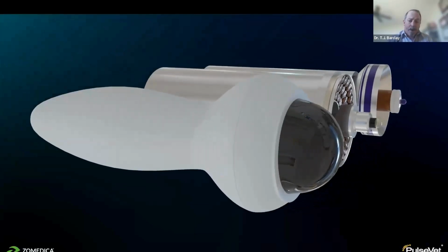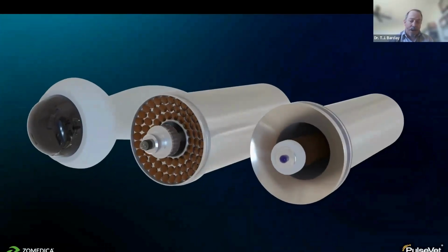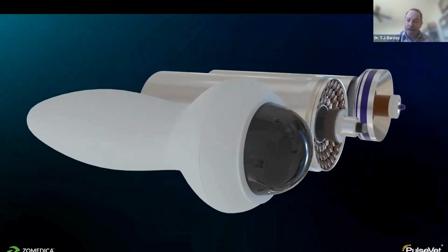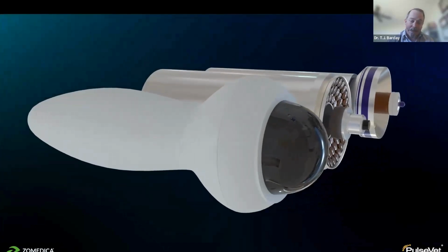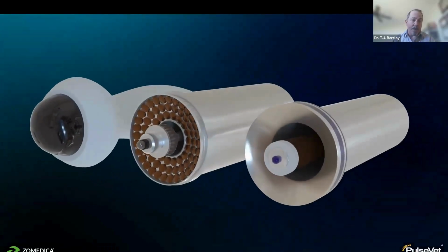Like I said, we're going to limit our discussion to focused shockwave. There are about three different methods of generating focused shock waves that are used therapeutically currently: the electrohydraulic method, the piezoelectric method, and the electromagnetic method. We're going to talk a little bit about how each one of those works.